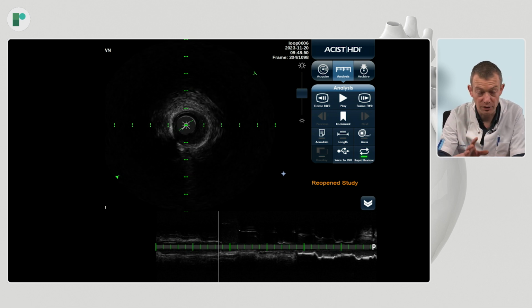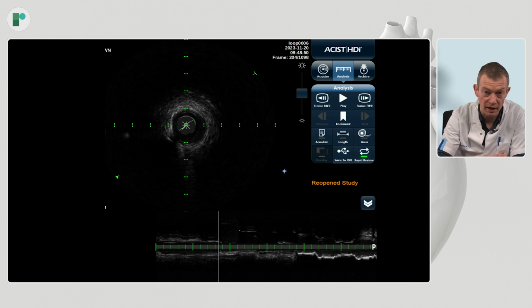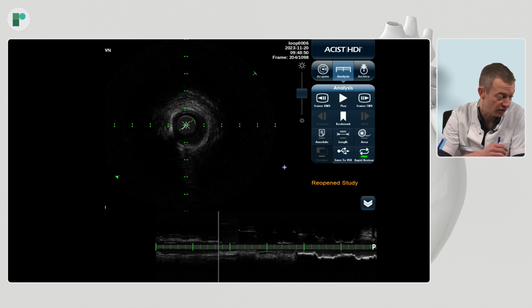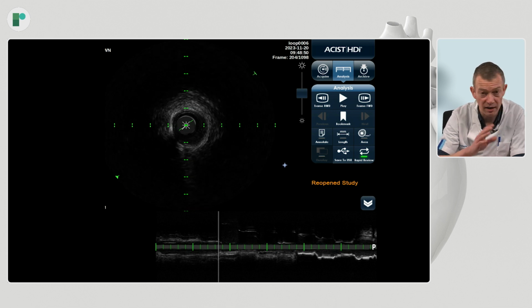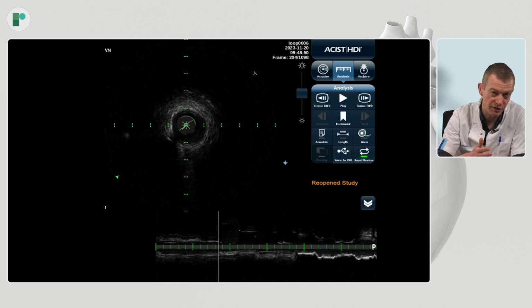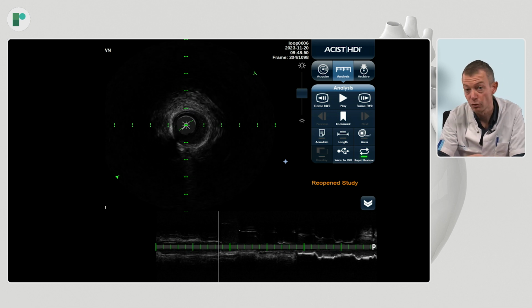We showed you the wiring of a side branch on IVUS, and how you can appreciate how that looked. In case this would have been a left main bifurcation, for instance, you would have been inclined to, at least I would have recommended, to rewire and take a more distal strut, which completely fits with the concept of the OCTOBER algorithm that we've recently seen really works in terms of getting the most out of your bifurcation stenting.